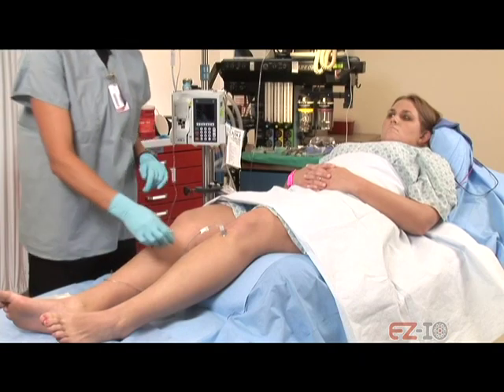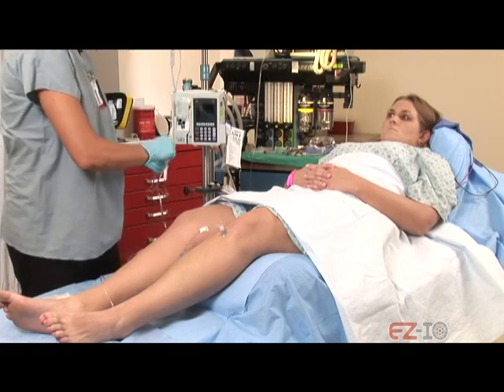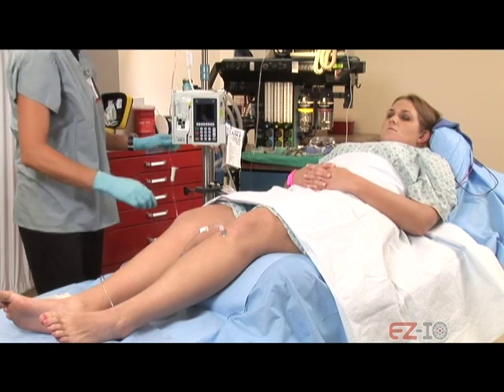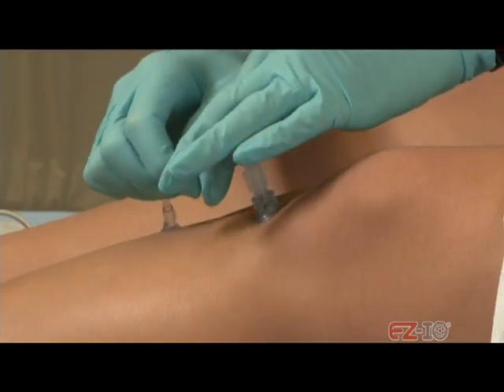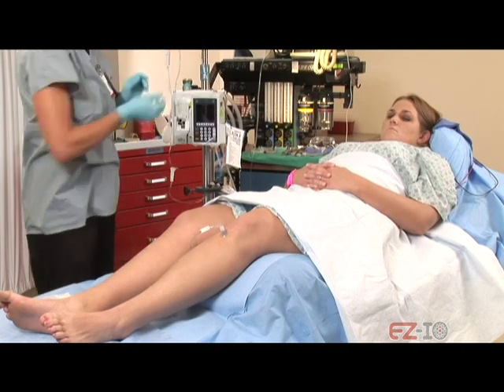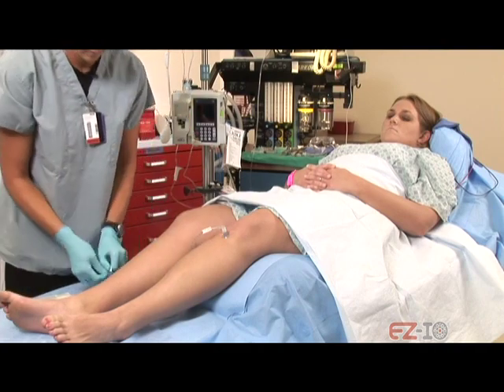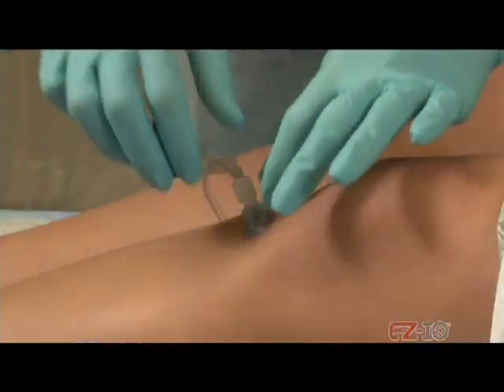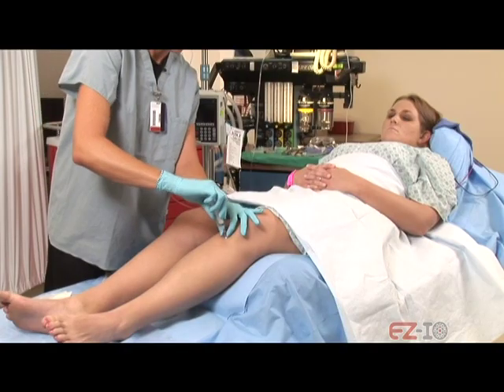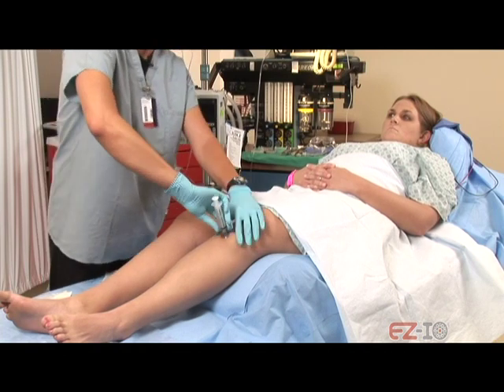Okay, Kelly, we're ready to get this out, okay? All I'm going to do is twist and pull this straight up while I'm taking it out, okay?